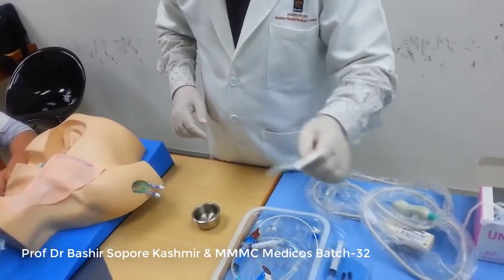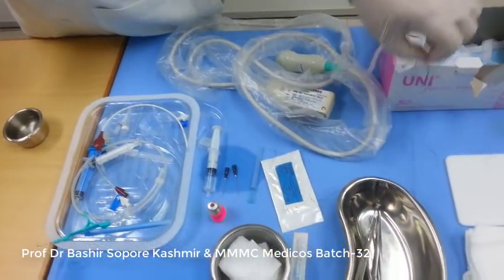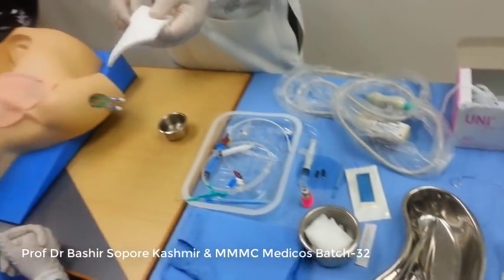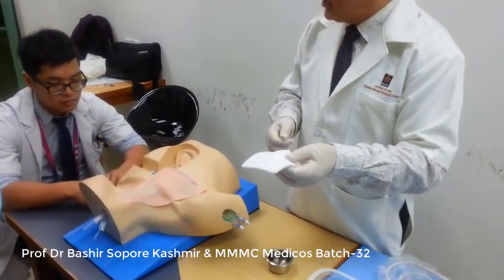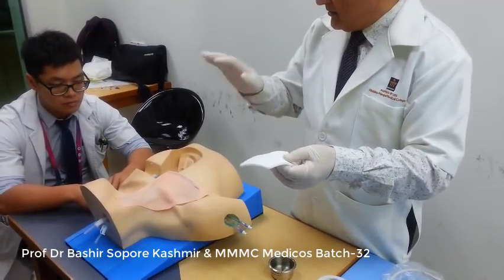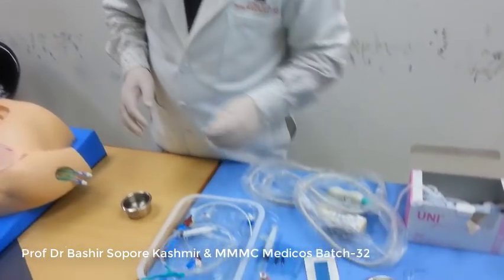You got my point? And this is the suturing needle here. Then we have an adhesive plaster or wrap, by which we can wrap the jugular venous catheter, or we can fix the adhesive plaster over the catheter. So everything is here. You got my point?